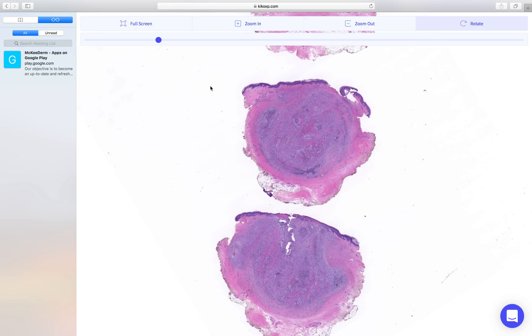Pheohyphomycosis is seen as a large cystic structure in the dermis, sometimes extending into subcutaneous fat, and there's usually a compressed pseudocapsule around it. It is a cystic structure characterized by granulomatous and suppurative inflammation.